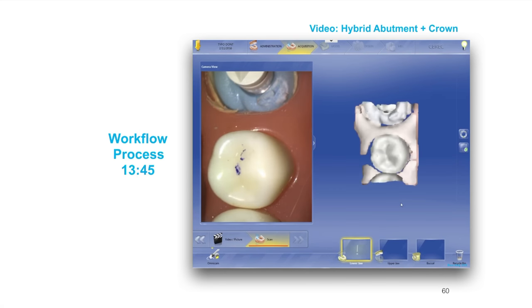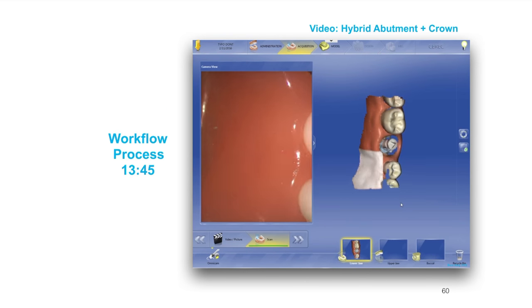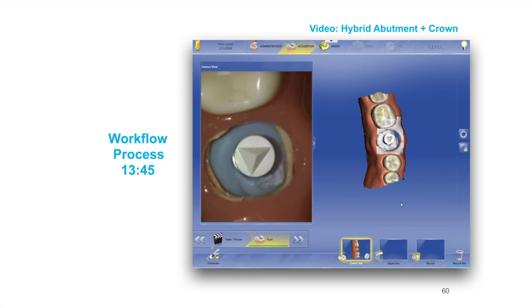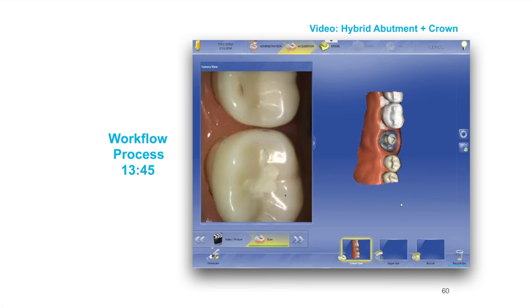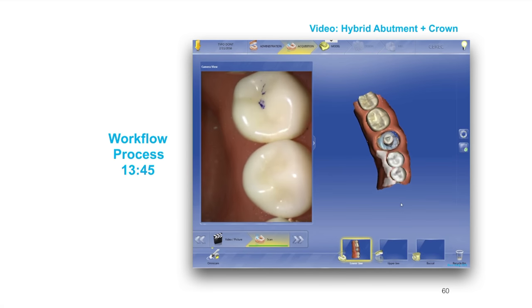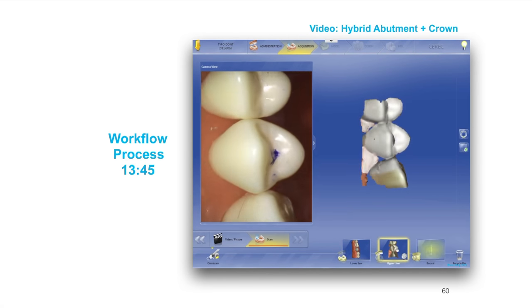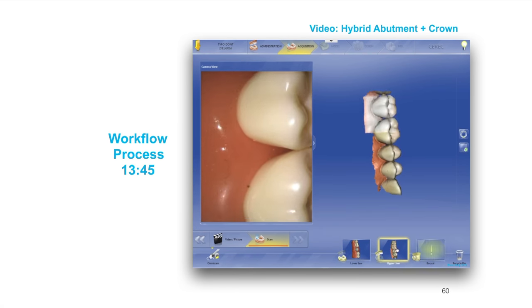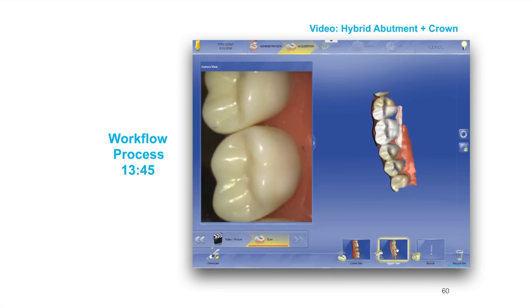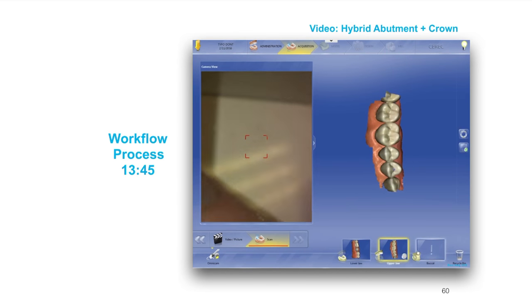Now we're going to image. I have a typodont here with an extracted tooth held in, and my tie base is held in with some blue bite. I'm taking a few minutes to scan, and you'll notice how little time I take. I've found in my experience that the less time you take to scan correlates to a much faster process, as long as you have the right amount of data. You don't really need to take five hours to scan. Now this is the opposing arch — I'm spending a lot less time scanning this. Generally in the mouth it'll take an extra 10 or 15 seconds per arch.